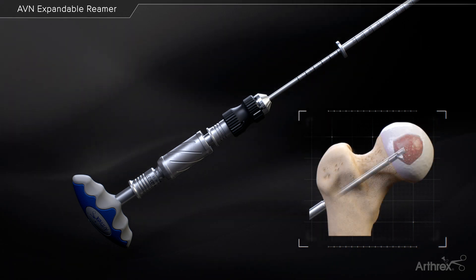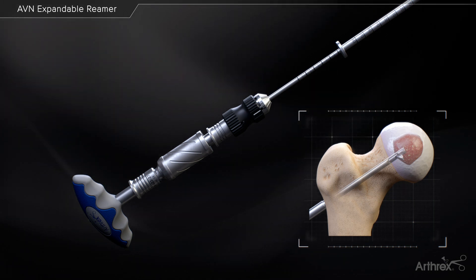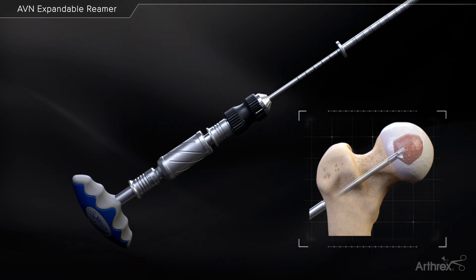After reaming is complete, remove the expandable reamer. To retract the cutting blade, push the knurled knob forward and twist counterclockwise.